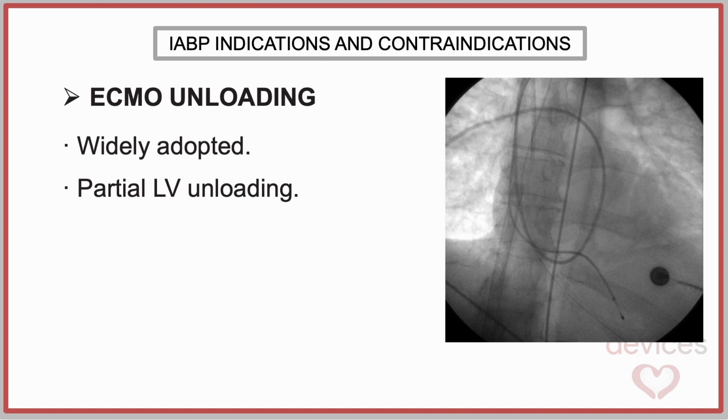It is important to note that this indication remains off-label and is not included in the manufacturer's instructions for use. Therefore, clinical judgment and institutional experience are essential when considering IABP placement during veno-arterial ECMO.